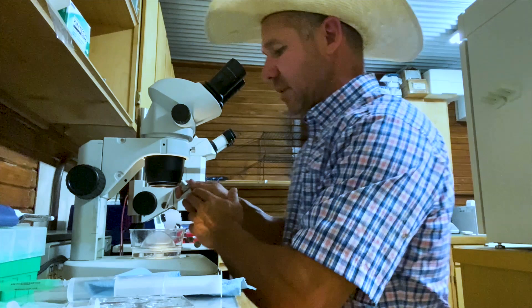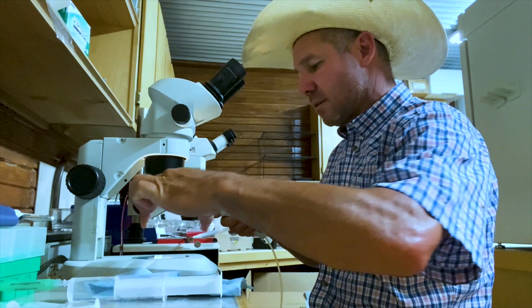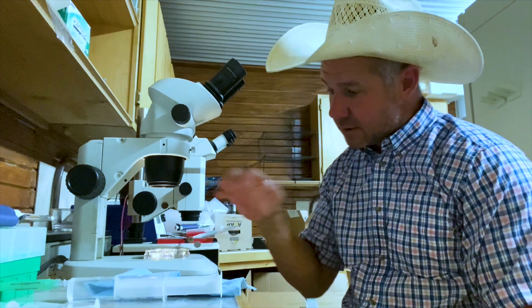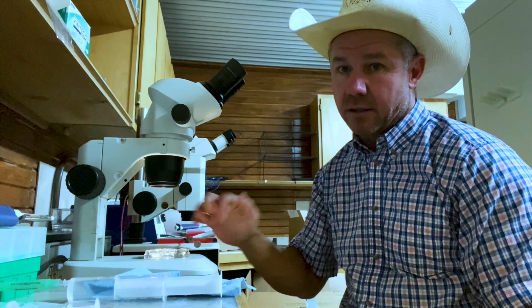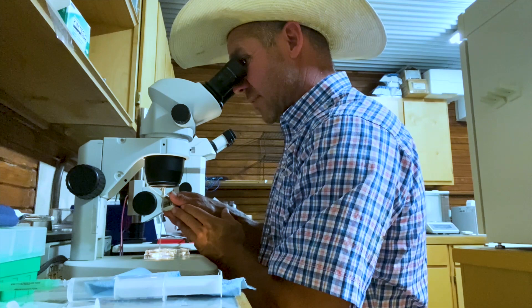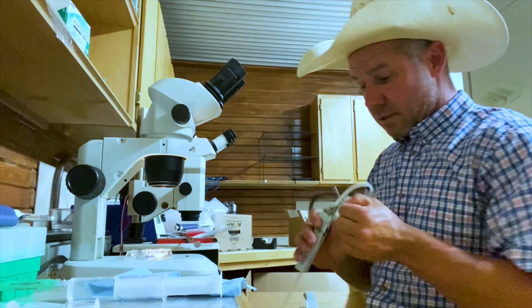I'm going to use another straw to load my embryo. I'm flicking the trash out of the way and loading the embryo, transferring it over here. I've got four wells — I'll go one, two, three, four. In that fourth well I'm going to let the embryo sit while I go get the recipient mare ready. Once the recipient mare is ready, I'll come back and load it. You've got to have pretty steady hands here. I'll load the embryo up, back down, and let it sit for a minute.